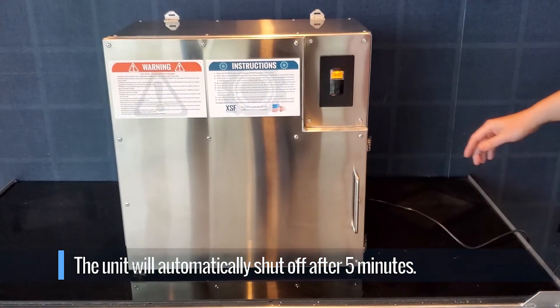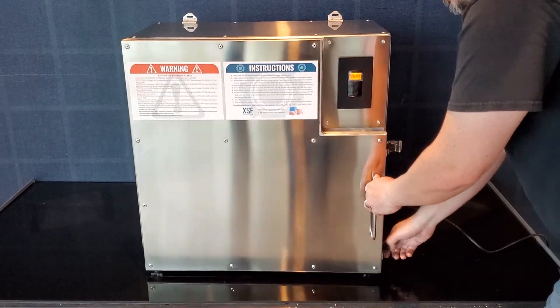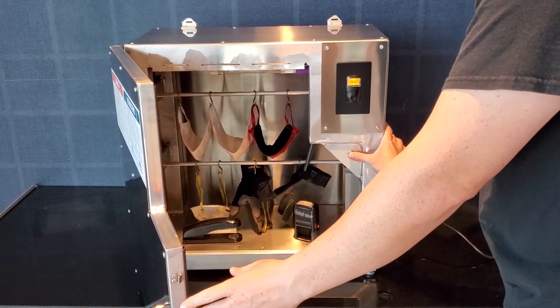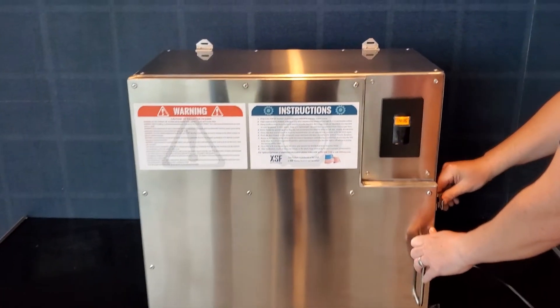If the cabinet is open during operation, the safety switch will automatically shut the unit off. Depressing the safety switch will briefly turn on the cabinet lights and confirm the unit is working properly once the door is closed.